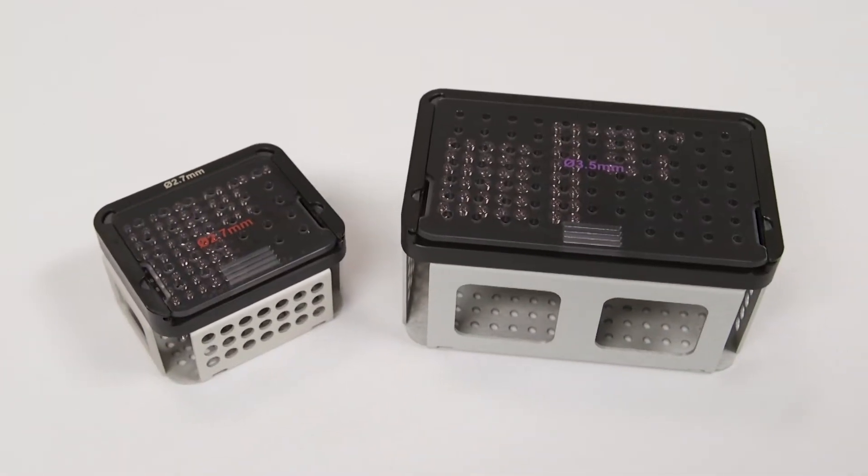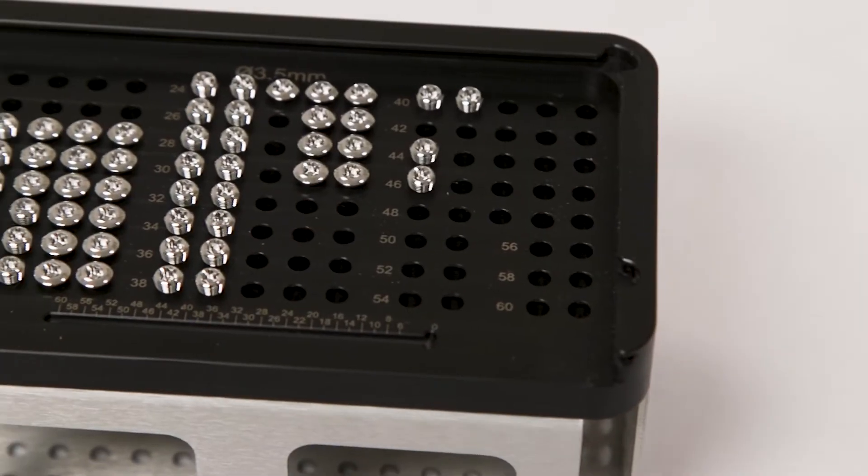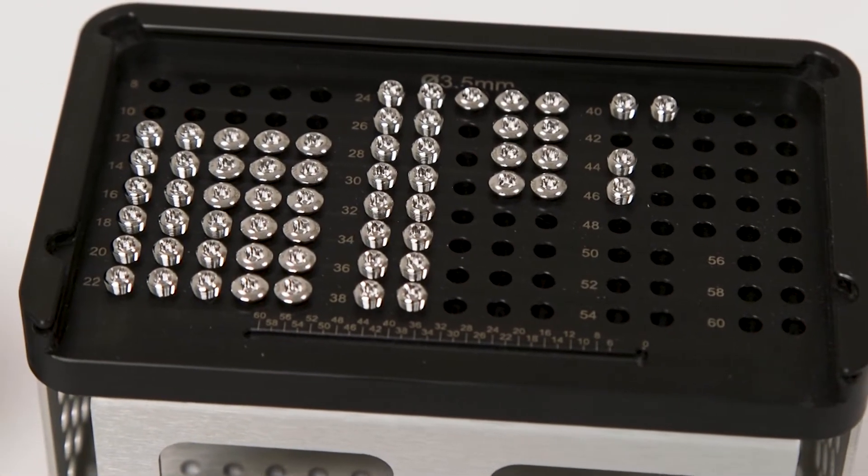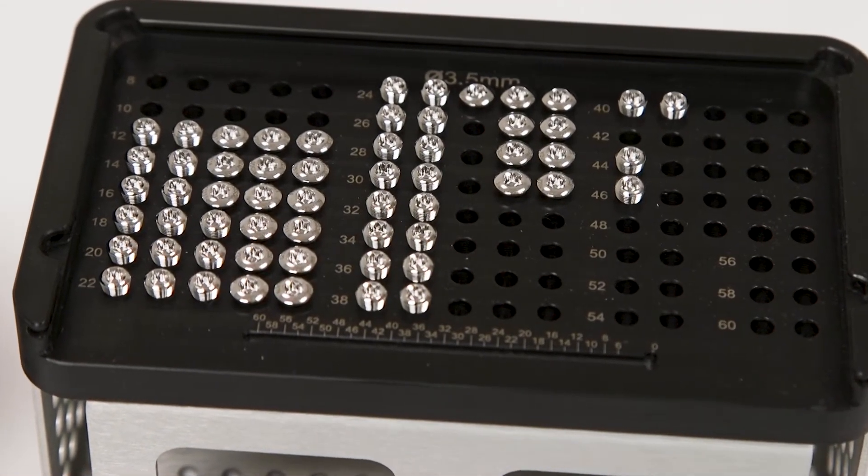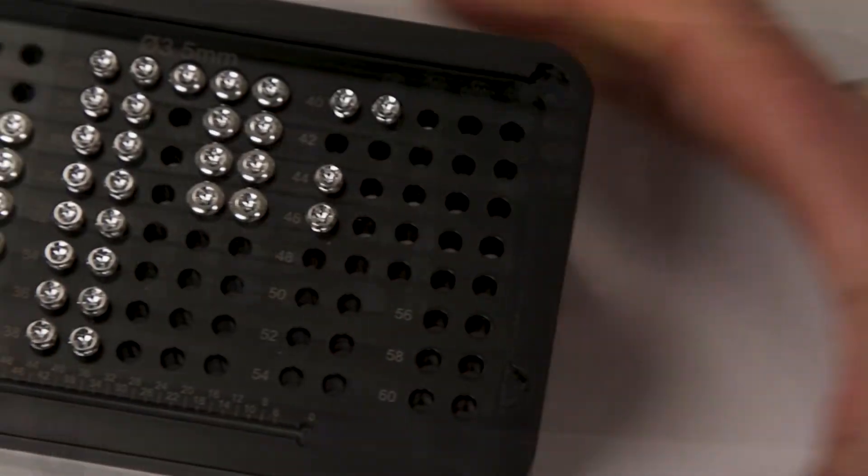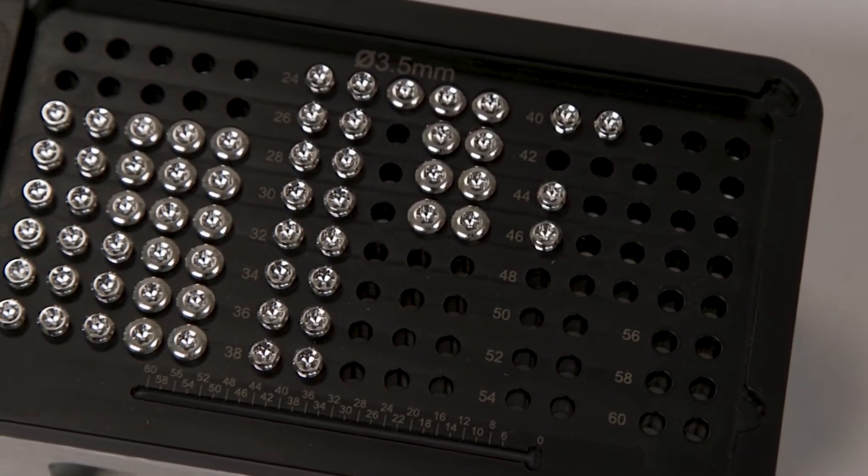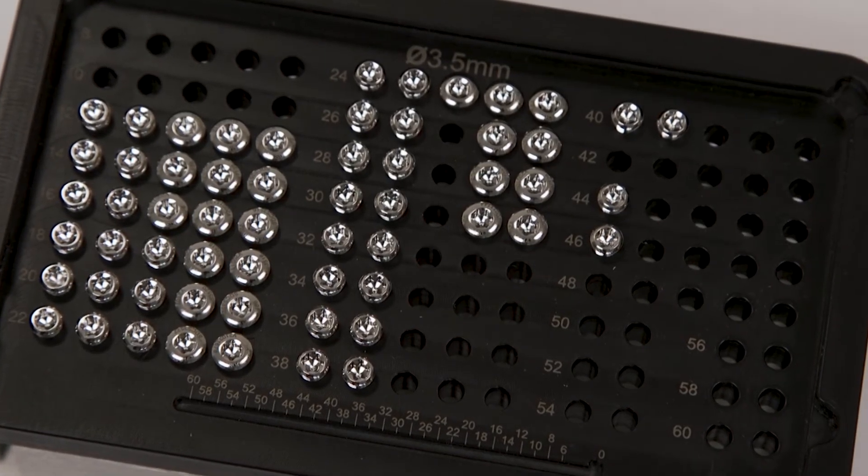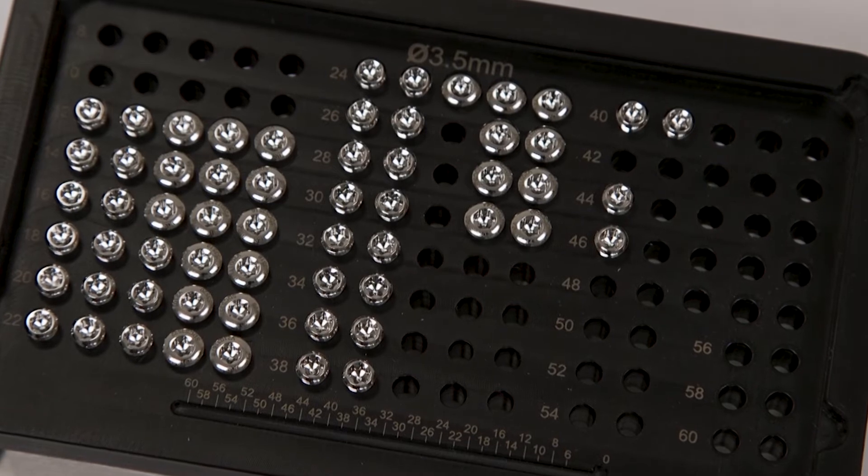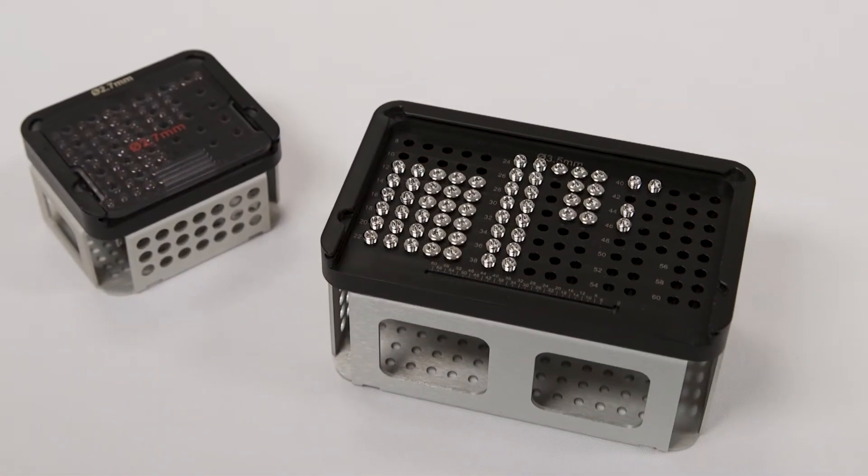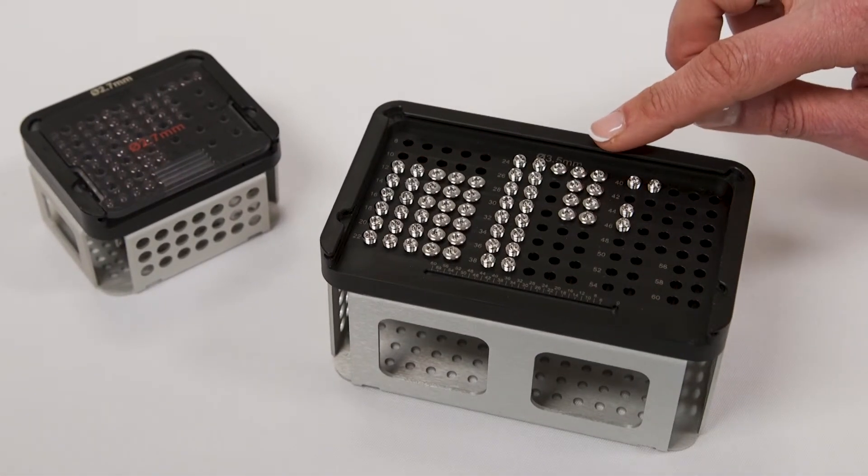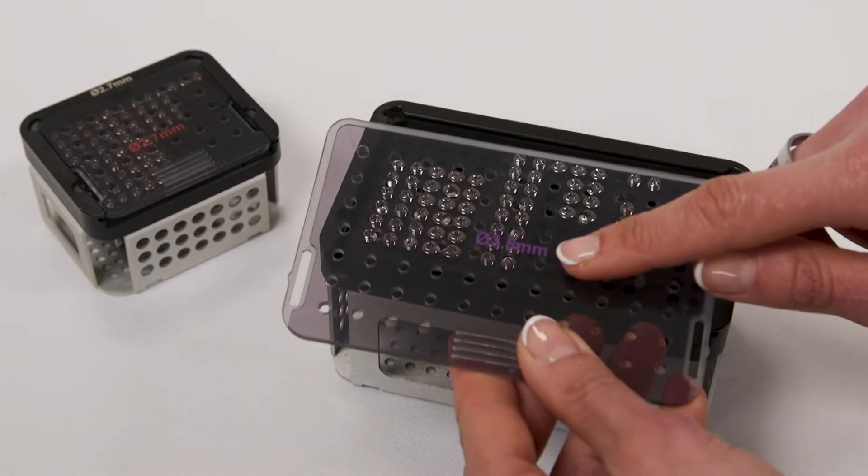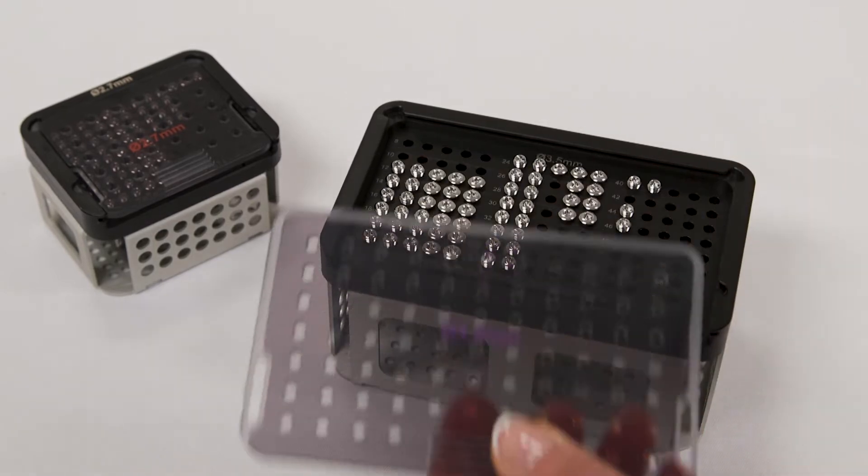The two screw caddies are supplied with a mixture of Star Drive Locking and Star Drive Cortical self-tapping screws. They are clearly marked in rows to make screw selection simple and feature a recessed measuring scale for double checking screw length during a procedure if necessary.